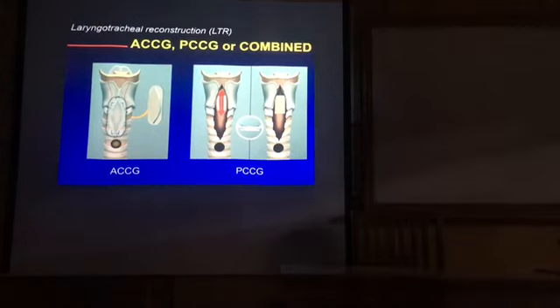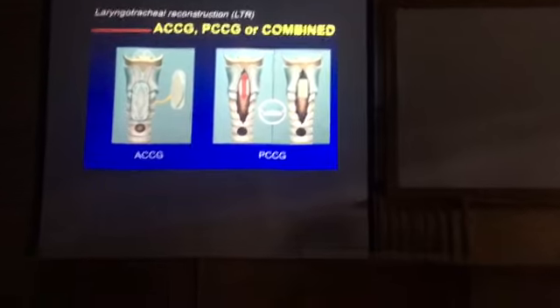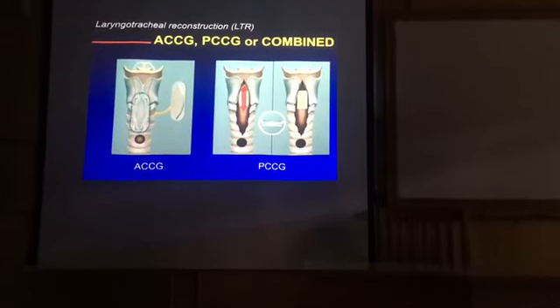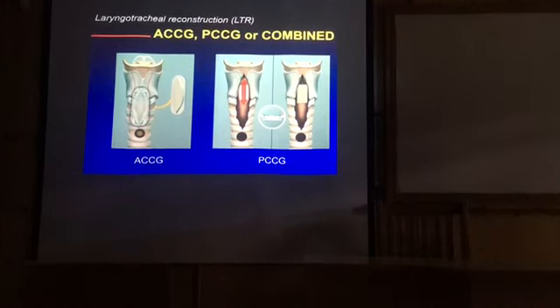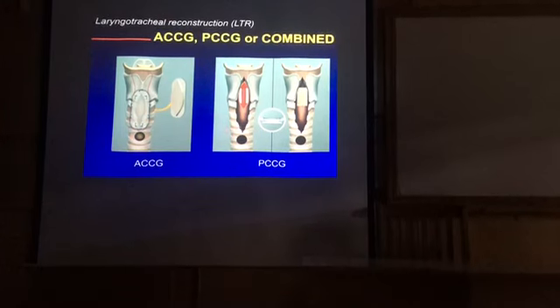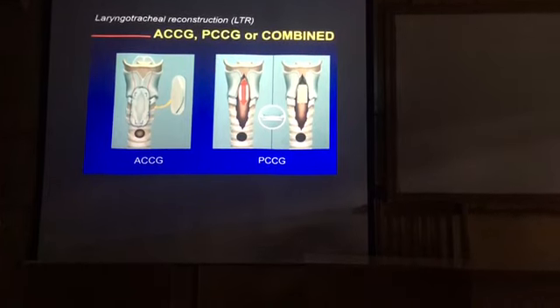What you are going to learn today is to do a full laryngofissure like this. So to do a full laryngofissure, usually when you have prepared the trachea, you will have the cricothyroid muscle on either side. It's not depicted on this diagram. You don't touch these muscles because this is strictly a midline surgery.